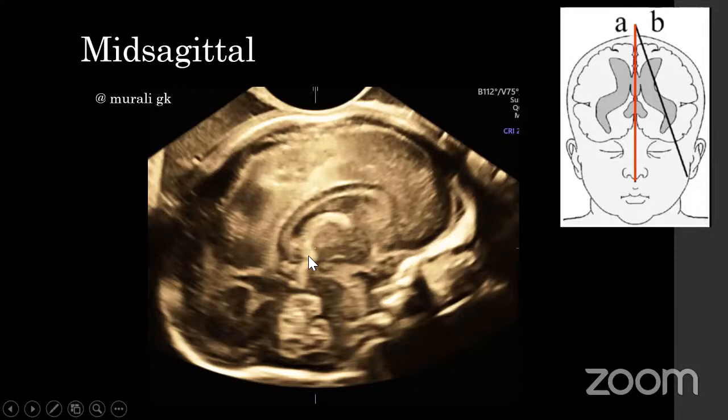Just going behind the tela choroidea, what you find is the thalami. The thalami come down caudally and continue imperceptibly into the midbrain. How do you identify the midbrain? Through the bump. This bump is nothing but the tectum of the midbrain. The midbrain continues imperceptibly into the pons. The pons is identified by the ventral belly. The pons continues as the medulla oblongata, right? So go further. Just posterior to the pons, you find a bright kidney bean shaped structure, which is shining in the infratentorial compartment or the posterior fossa.